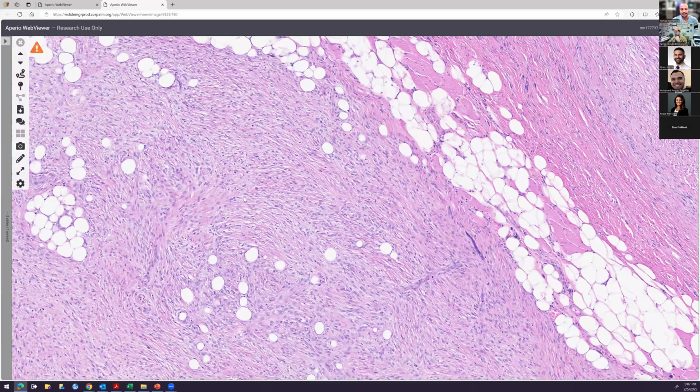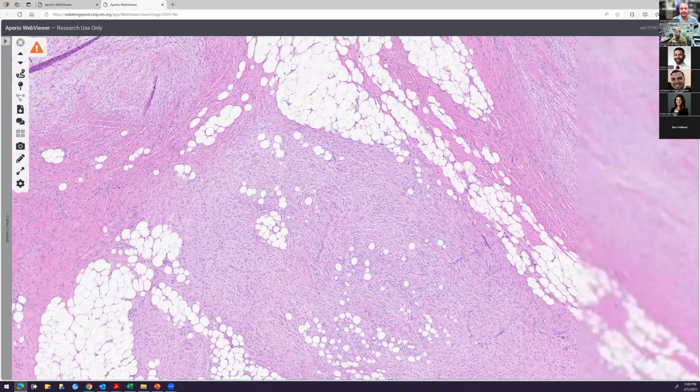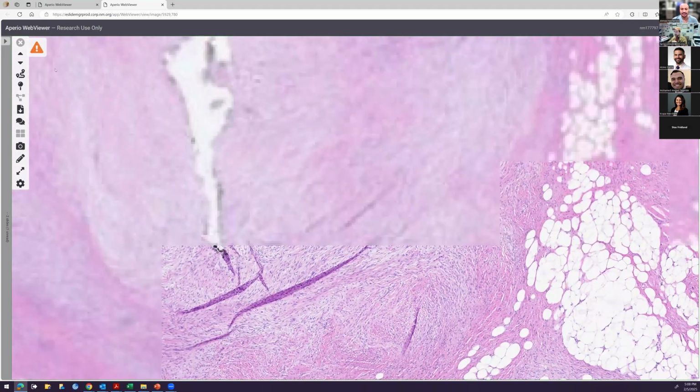EMA? Right, EMA. What's EMA? Come back to your epithelial membrane antigen. It is epithelial membrane antigen, but remember, it's also MUC1, right? So that's another way to remember that. Don't forget EMA is one of these epithelial mucins, it's actually MUC1. So MUC4 is generally diffusely positive in low-grade fibromyxoid, but MUC1 is also commonly positive at times as well.